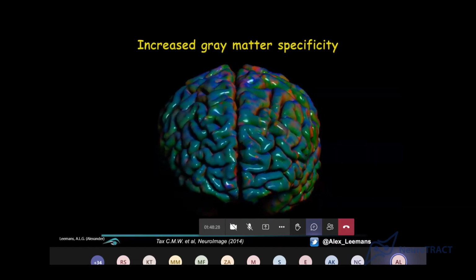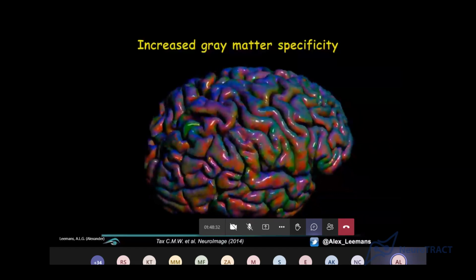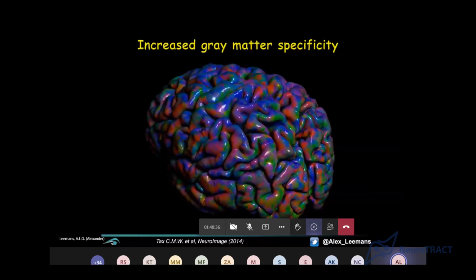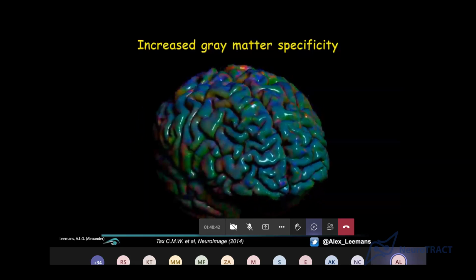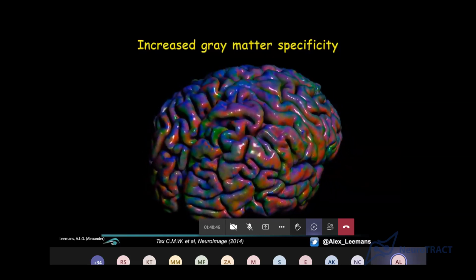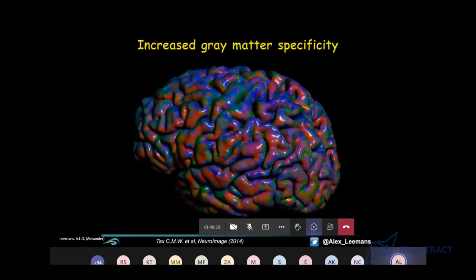And so, well, I just showed this animation because I liked it. So what I basically did here is you can also look at gray matter, because we've mostly been focusing on white matter, right? Because there's the fiber pathways, but obviously gray matter also has a structure, the laminar structure, the different layers.